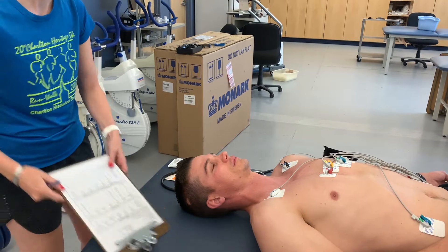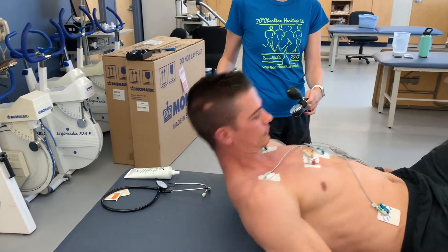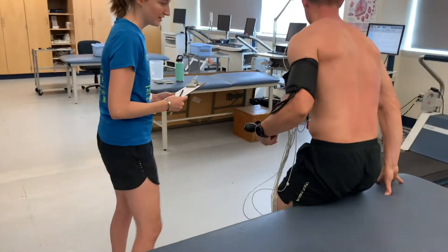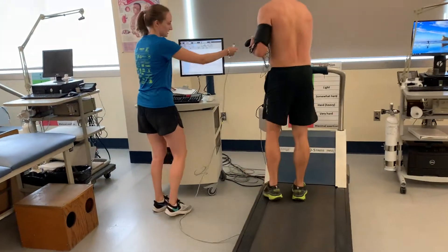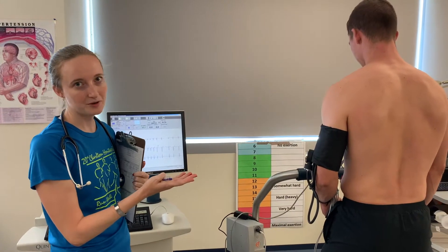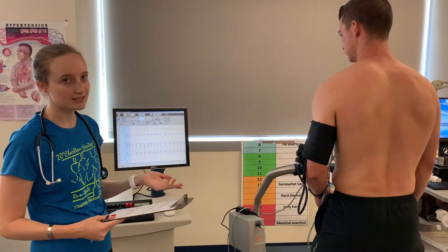Okay, you can go ahead and sit on up. We'll have you just walk over and secure all the wires to the treadmill. Now we have him over here just straddling the treadmill and we're going to go ahead and take the standing values.